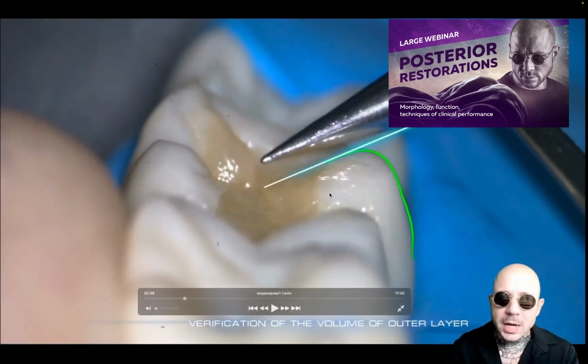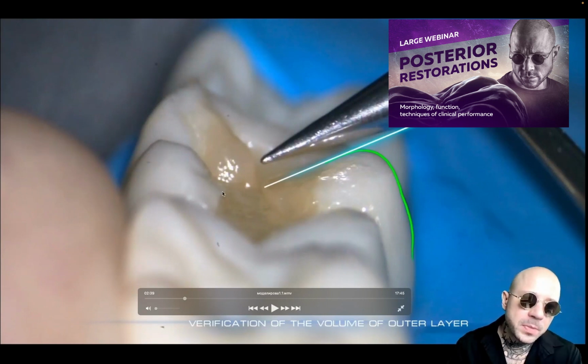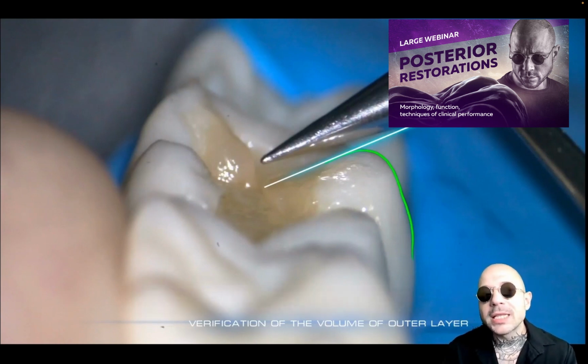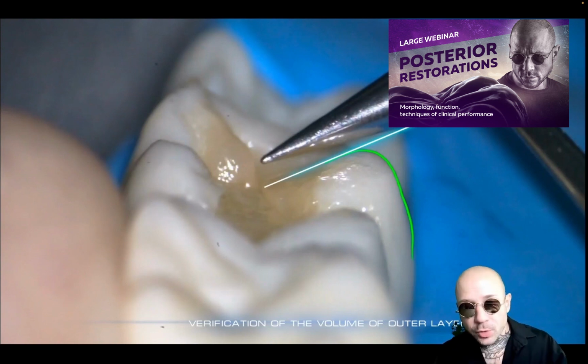So you see that part of enamel here. Working with the buccal cusps, we will try to adjust the instrument under the angle these enamel parts have, and of course we can objectively get the same angle only by taking a side perspective of view.